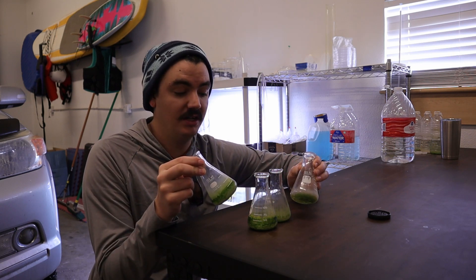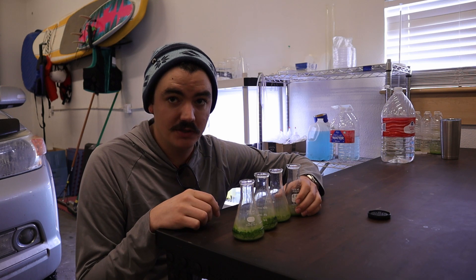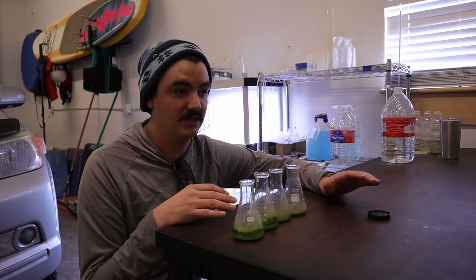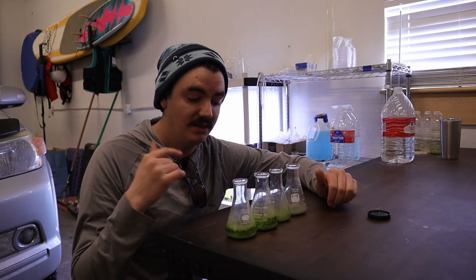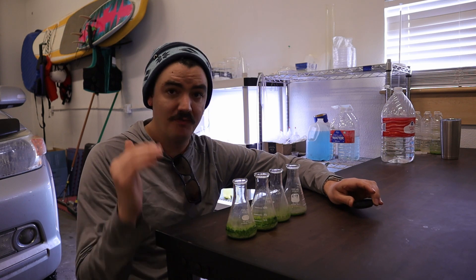We had some failures on our end. These four little 125-milliliter Pyrex flasks that we had started samples in failed, and our pond water that we were so proud of also failed. The reason behind the failure was totally user error — lack of attention. I was out of town for a while, then I was affected by COVID, so I wasn't able to tend to these guys for over a month and they just kind of sat and decayed.